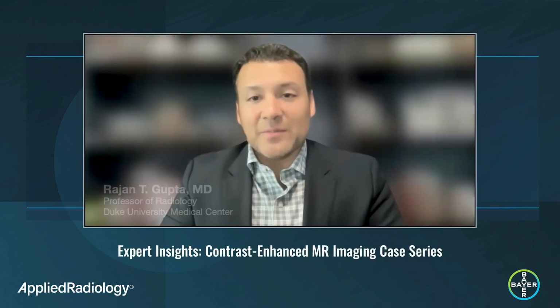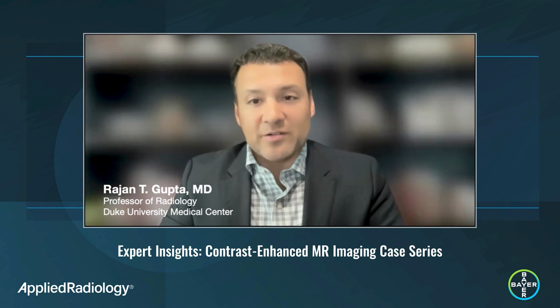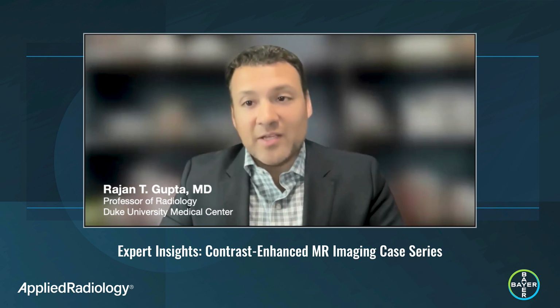Hi, my name is Dr. Raj Gupta, and I'm a professor of radiology at Duke University Medical Center. I'm happy to be here with you today to talk about the use of EOVIST.